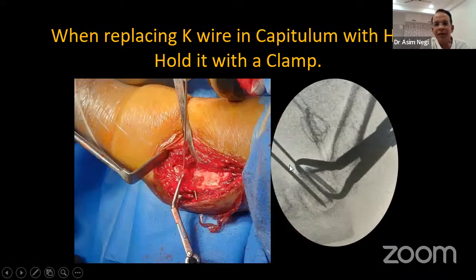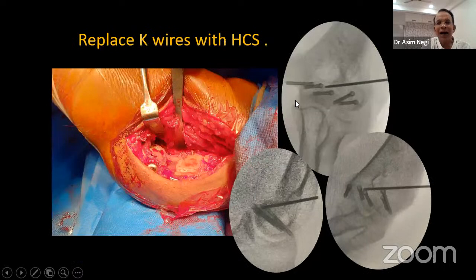This is the anterior prong of the clamp. And this is posterior. How much medially can you go? And where do you rest that tip? I am showing you this much medial you can go. There are 5, lateral to medial.